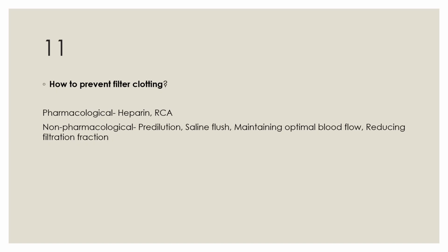Introducing replacement fluid before the filter dilutes the blood, reducing the concentration of clotting factors and potentially decreasing the filtration fraction, which can be a factor in clotting. Maintaining optimal blood flow and regular saline flushes can help clear any clots that may have formed, particularly in the absence of anticoagulation. Minimizing blood-air contact in the circuit can also reduce clotting risk.